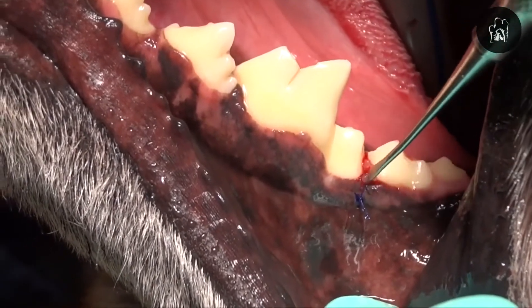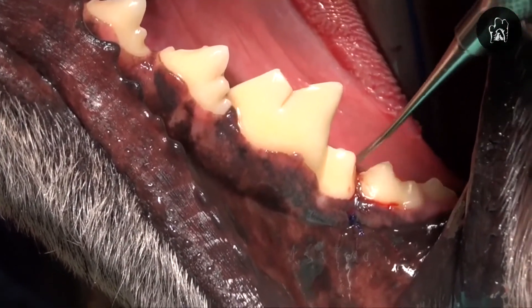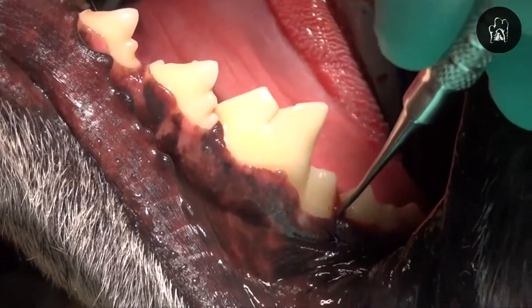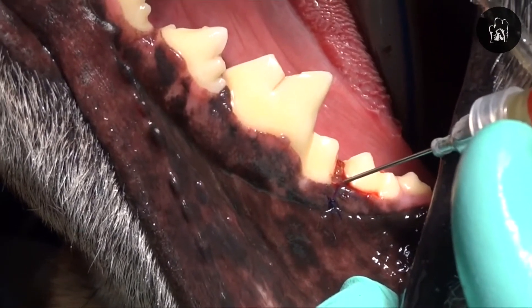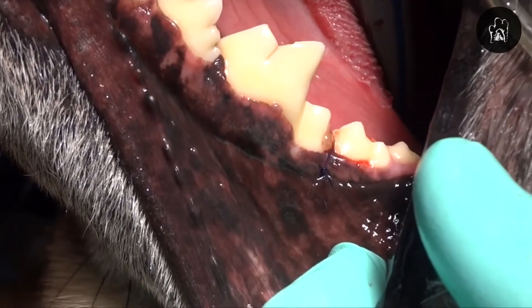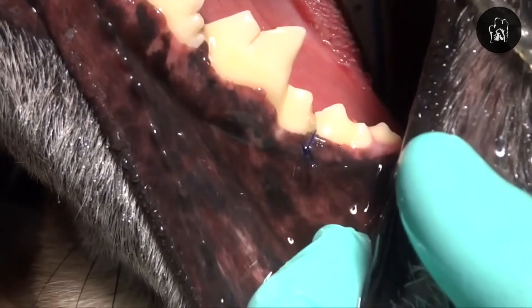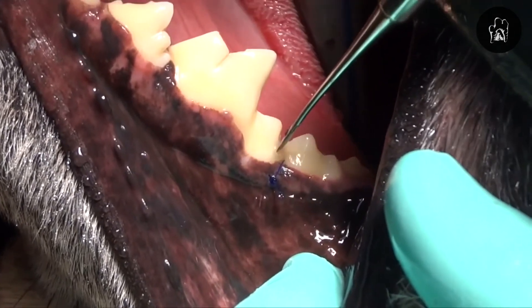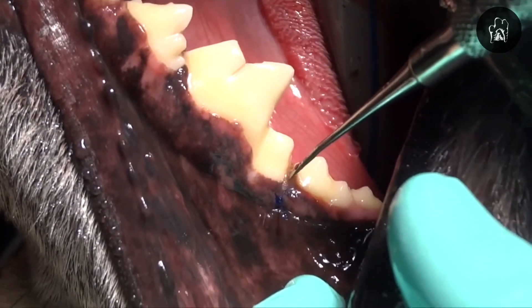You can also create a membrane on a glass slab using doxyrobe, solidify it, and then place it in the open defect before you suture — you may want to do that for larger defects. For a small defect like this, this is a very simple technique that you can use with a product you should already have in your practice if you're doing dentistry, that we use in gingival pockets to decrease pocket depth and increase attachment. Here we're using the periosteal elevator again to help place that down on top of that bone graft. It also helps to seal that to make sure none of the bone graft leaves that site.